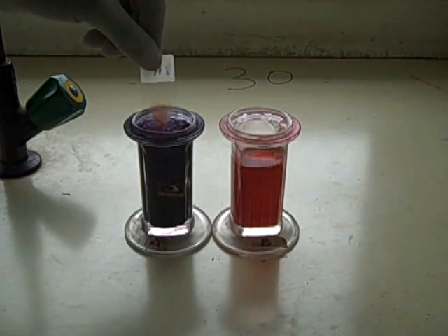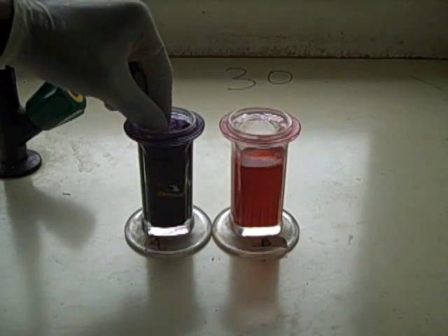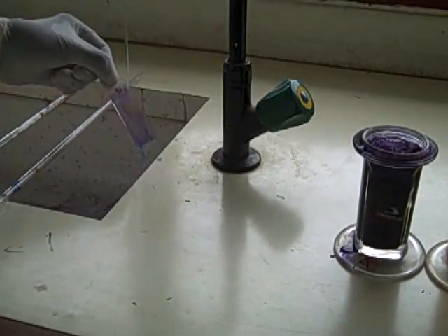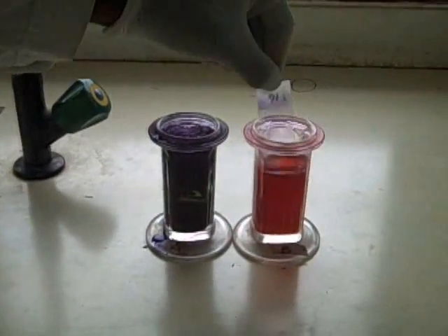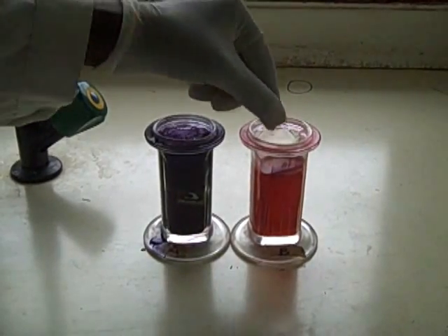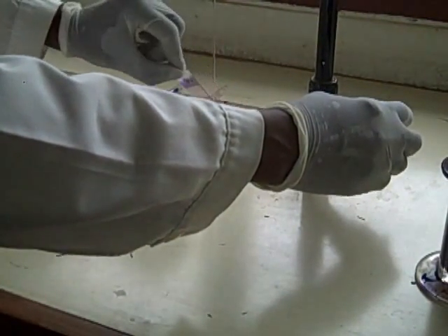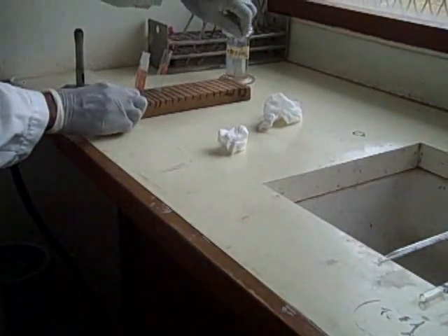Stain the thick smear in Field stain A for 5 seconds — this dehaemoglobinizes the red cells. Wash under tap water or buffered water. Put it in Field stain B for 5 seconds, after which you wash under tap water or with buffered water. Air dry it on the draining rack.